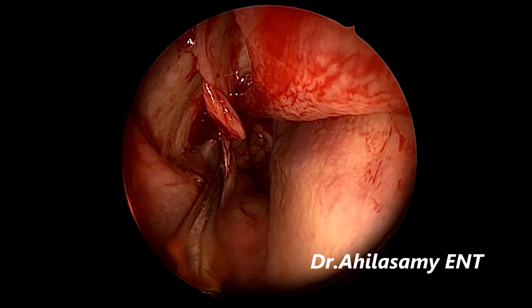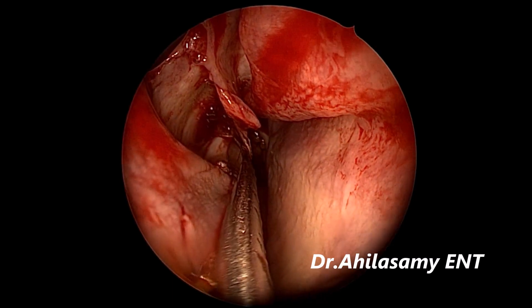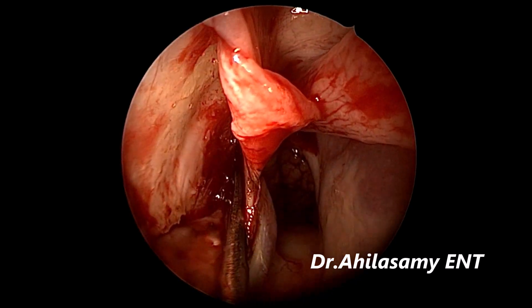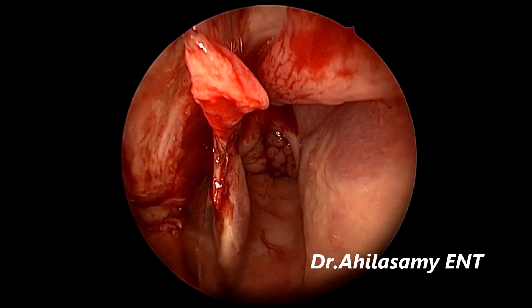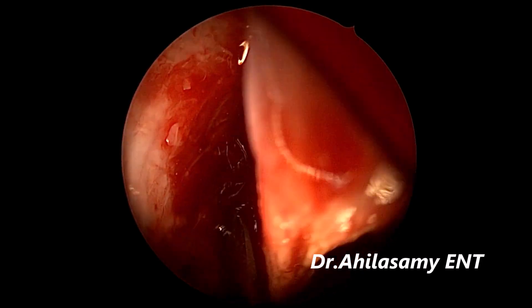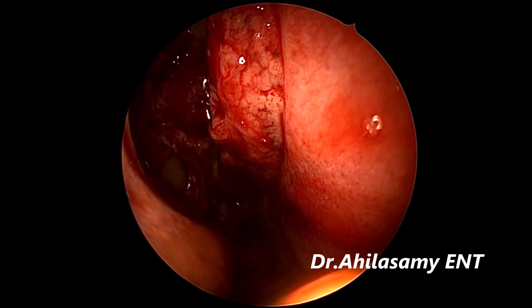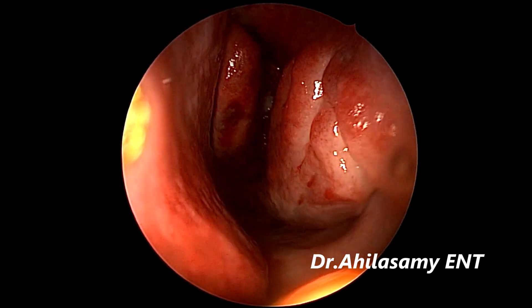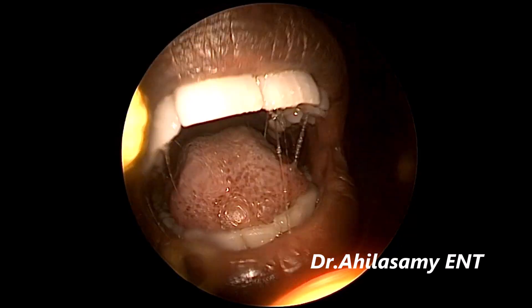Don't blindly cauterize that area as some people are doing — to have a very good result. Some still more slender nerve fibers you can see. Please watch these videos on a bigger screen to appreciate the field quality. Hardly any bleeding. I will not be packing the nasal cavity and the patient is comfortable.